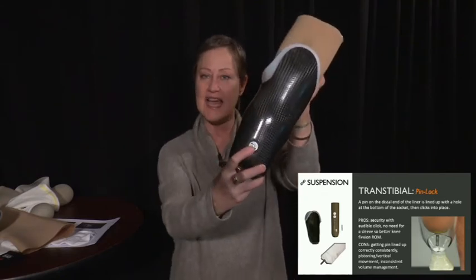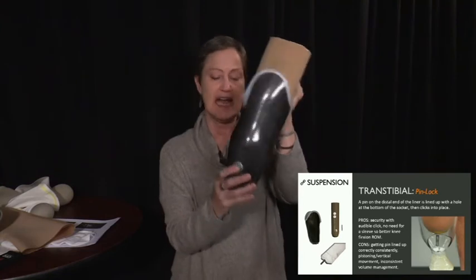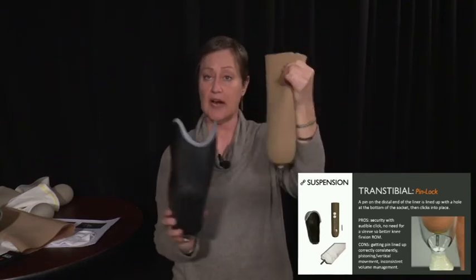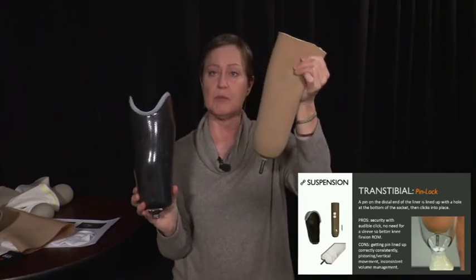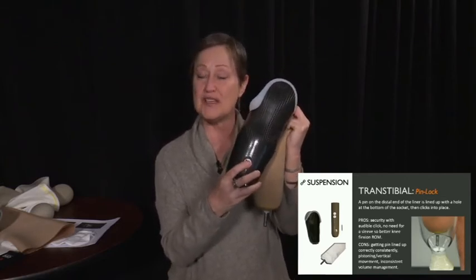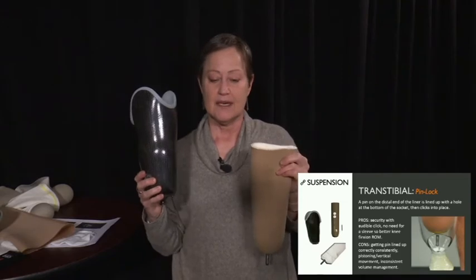This is a button on the medial aspect, and the patient has to bend over and mash the button to be able to unlock it and pull the liner out. Now, this button could be put in other places depending on the patient's mobility. But a lot of these folks who are less mobile, leaning all the way over, finding this button, pushing the button with one hand, and then sliding the prosthesis off can be a little tricky for them.